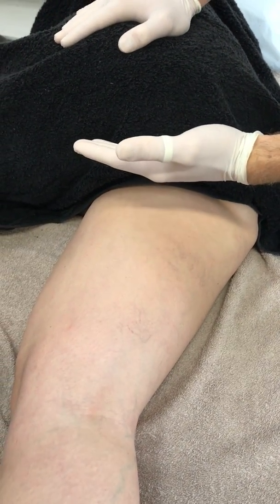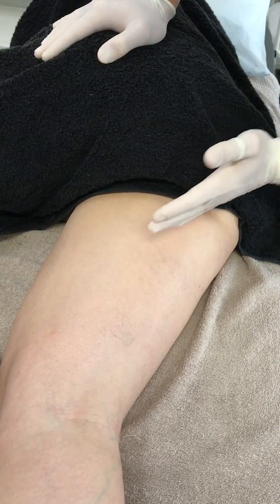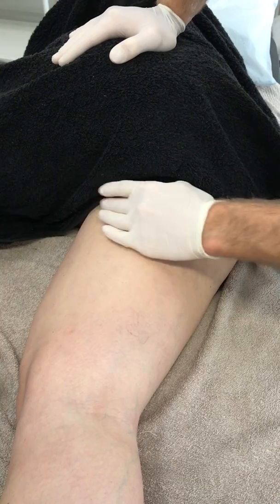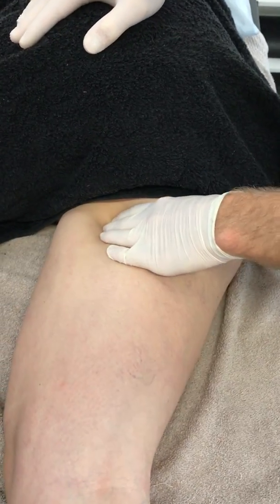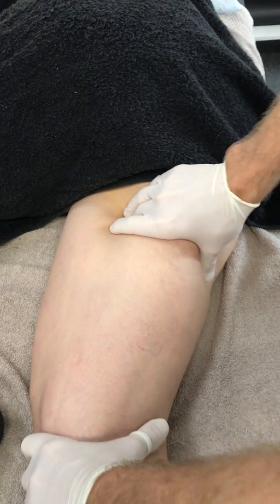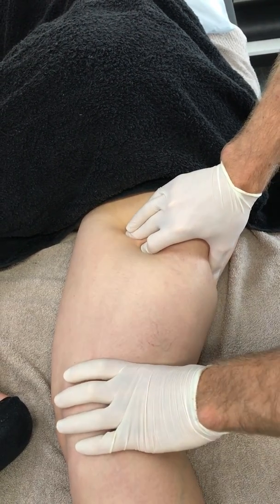So Adductor Magnus, as we know, comes from the inferior pubic ramus and goes posterior as well, sort of coming off the ischium as well, and cuts down, runs medially down through here. So it sits posterior to adductor longus, which will be the most prominent in the proximal medial thigh here. So you would move posterior to that and palpate in there, which you could use a little bit of adduction to bring it up.